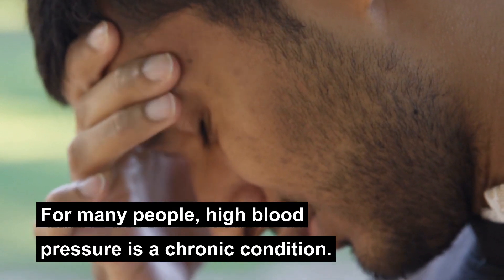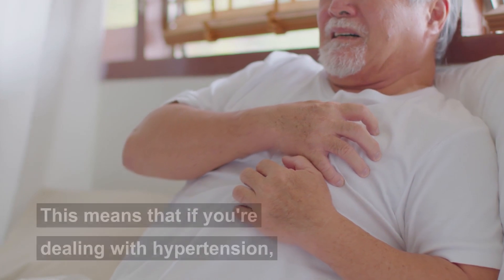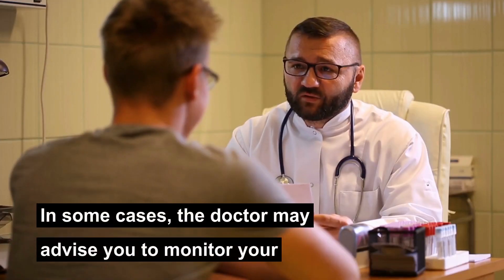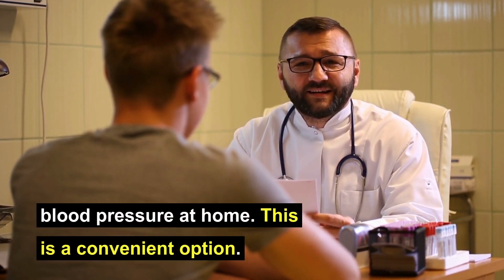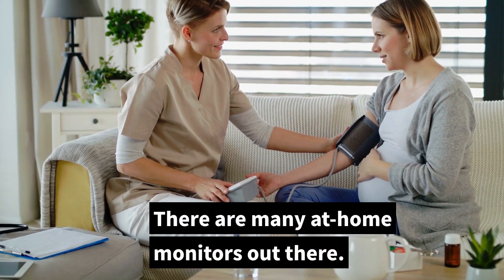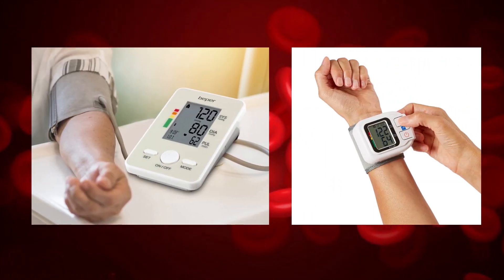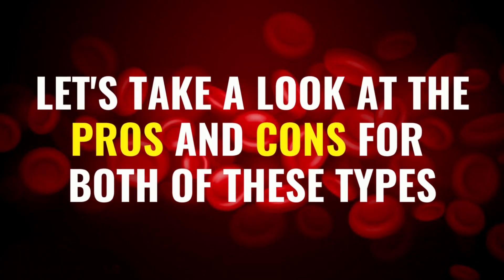For many people, high blood pressure is a chronic condition. This means that if you're dealing with hypertension you may have to monitor your blood pressure frequently. In some cases the doctor may advise you to monitor your blood pressure at home. This is a convenient option but choosing the right blood pressure monitor can be tricky. There are many at-home monitors out there, but they all can be categorized into two types: the upper arm monitor and the wrist monitor. Let's take a look at the pros and cons for both of these types.